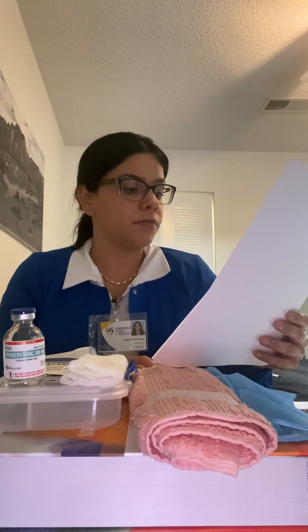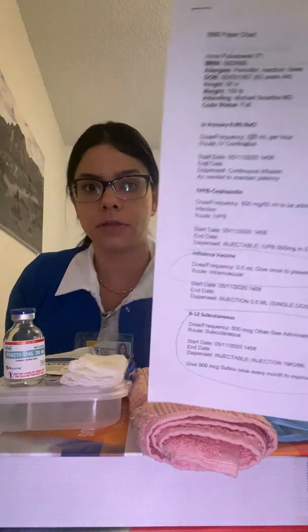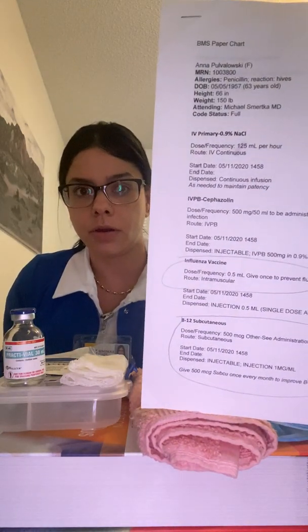Right now, I'm going to proceed to verify the flu vaccine against the medical record with the physician's order. So for Anna, I have a flu vaccine, and it's 0.5 ml. That's the dosage. The route is intramuscular, and the time is now. That is something that you can see here on her chart. So I have done my first check, making sure that I have the right medication for the right patient.